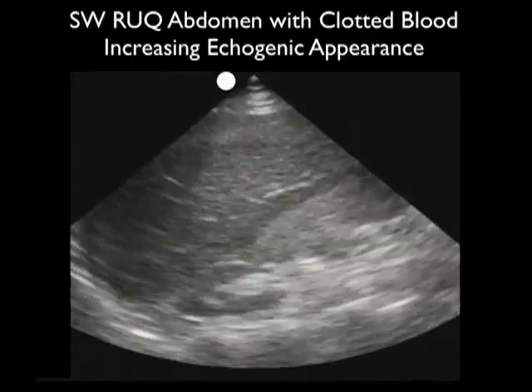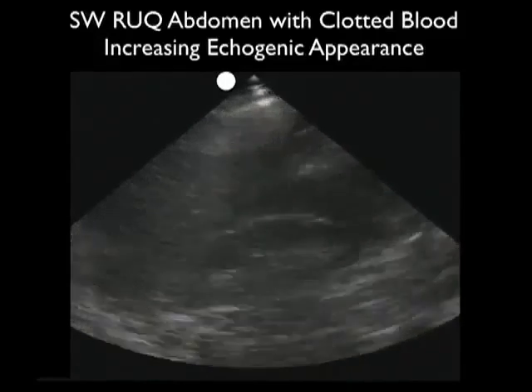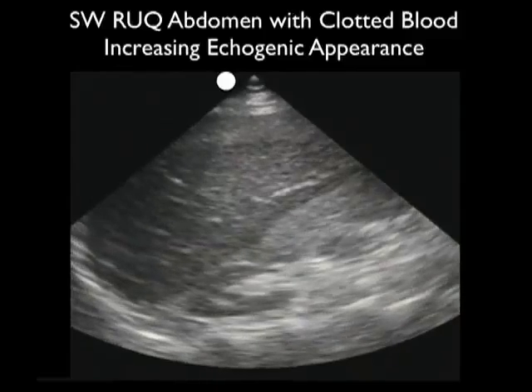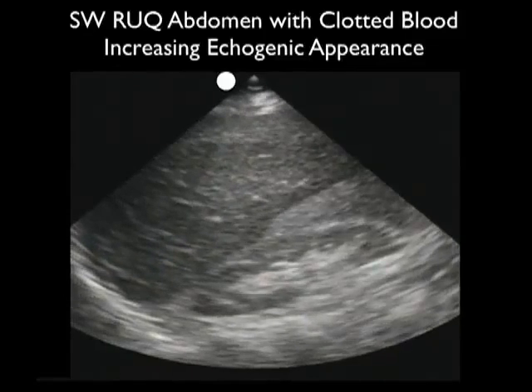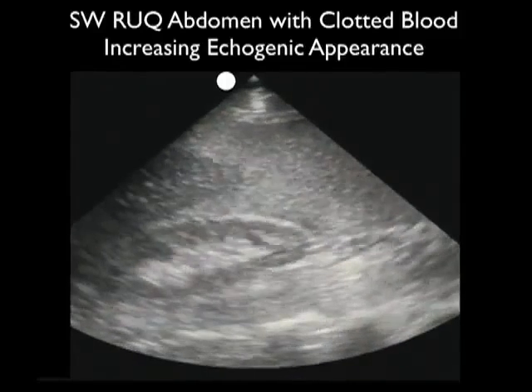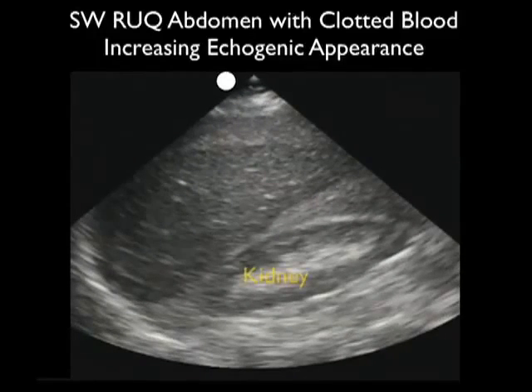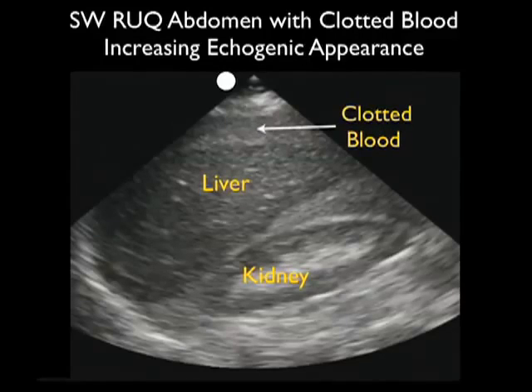In this video clip, a patient was stabbed and had a significant downtime before being brought to the emergency department. As we look at the hepatorenal interface, we see a large amount of clotted blood there, made up by that echogenic or lighter appearance of the blood there. Notice that the large amount of blood extends into the right paracolic gutter as we scan inferiorly. And here we can see the liver, the kidney, and the clotted blood, that more echogenic or lighter blood, in Morison's pouch.